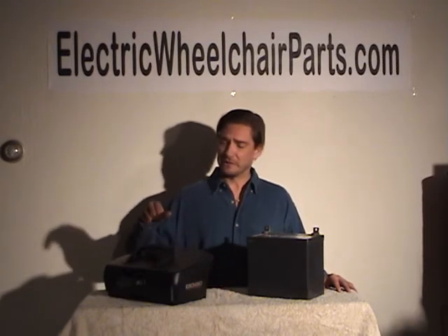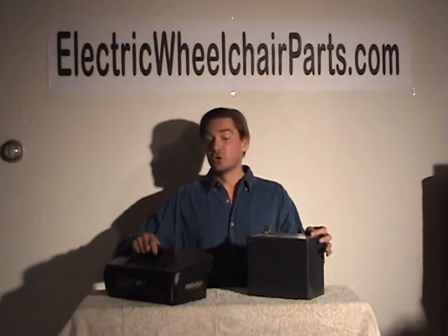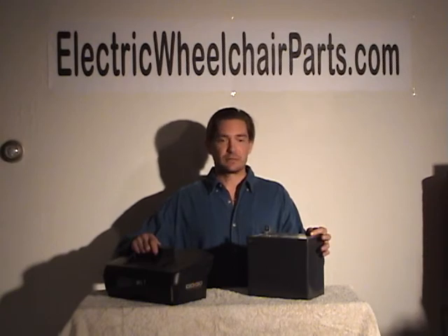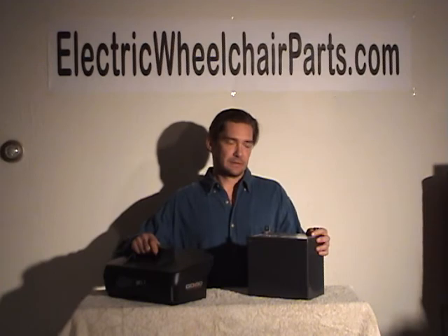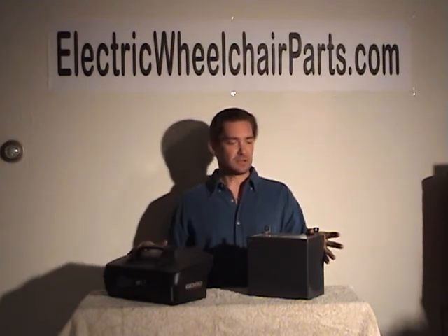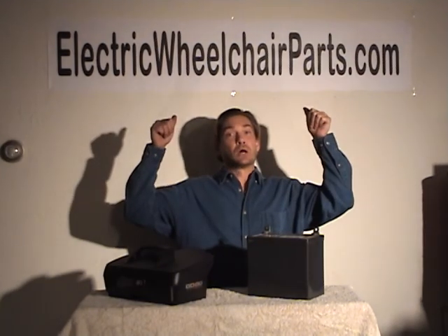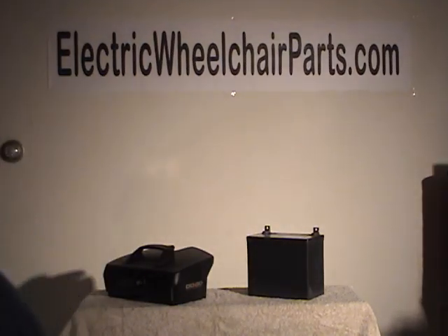That's really about all you need to know about batteries, except that they will always last longer if you charge them when they need to be charged — as opposed to using your scooter for half an hour and then charging your batteries all night. You don't really need to do that. So that's what we have to say about batteries. We have them all, starting from $129 at electricwheelchairparts.com.